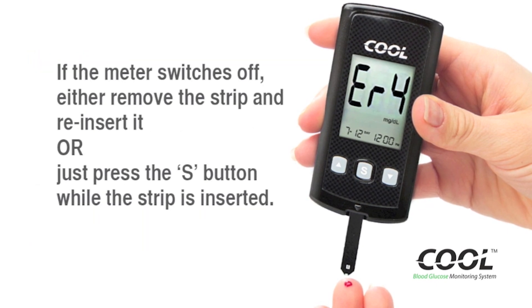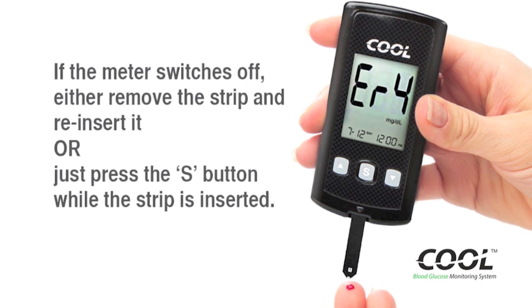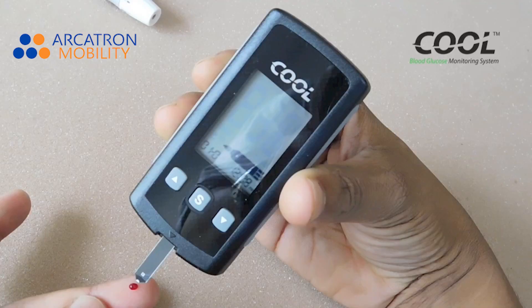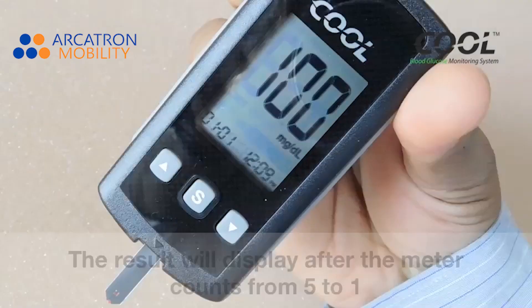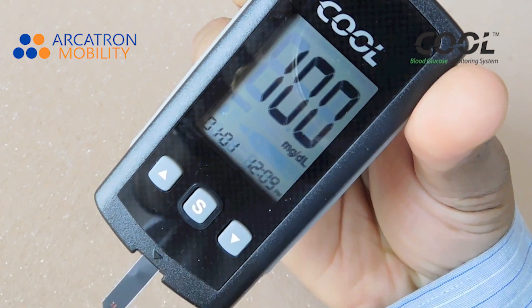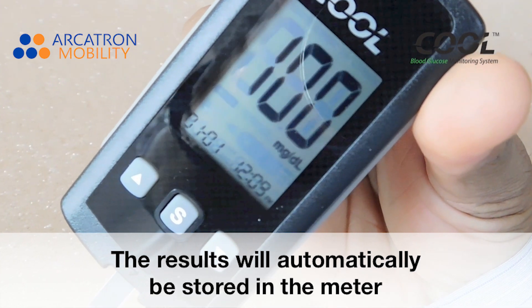If the meter switches off, either remove the strip and reinsert it, or just press the S button while the strip is inserted. The result will display after the meter counts from 5 to 1. The results will automatically be stored in the meter.